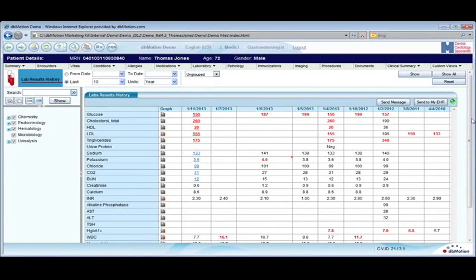So there's normalization of terminology. Again, it's presented in the terminology that the end user is used to seeing. So if I'm used to seeing something as a glycohemoglobin, all the hemoglobin A1Cs and glycohemoglobins will come over in that terminology to me, and it might be different than another user, again, who's consuming that in another language.